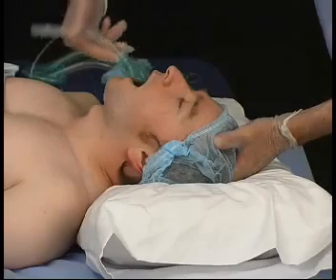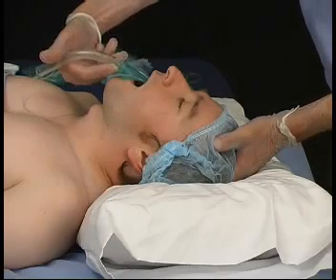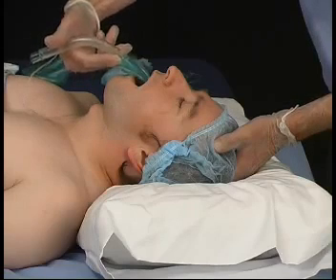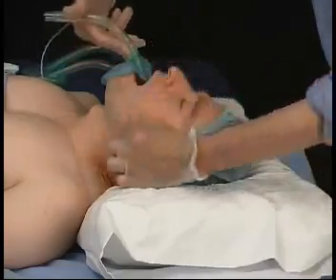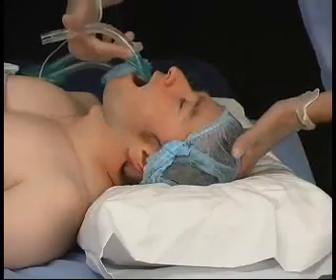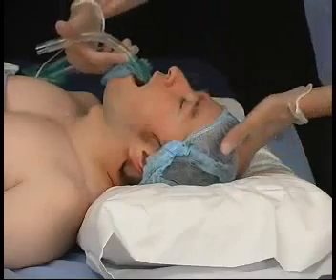because you're going to utilize first the hard and then the soft palate of the patient to perform a sweeping action that optimizes the anatomy as an introducer tool. Inserting the laryngeal mask vertically or obliquely brings about difficulties, but by following the curve created by the palate, rather than bouncing off the back of the throat, is by far the simplest method of effective insertion. So we are ready now to start inserting the laryngeal mask airway.